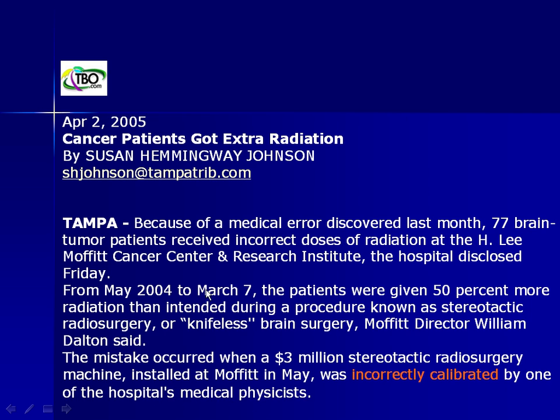The background of this is a new machine, and as is common now, we use Excel spreadsheets. We used to do everything by hand or slide rule. And to calibrate the machine, there were some incorrect entries in that Excel spreadsheet that weren't caught until actually the RPC visited and picked up the error.